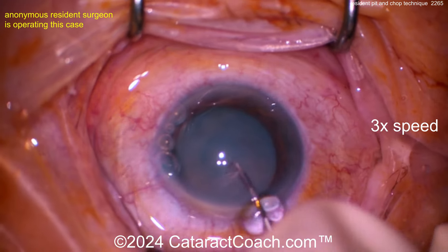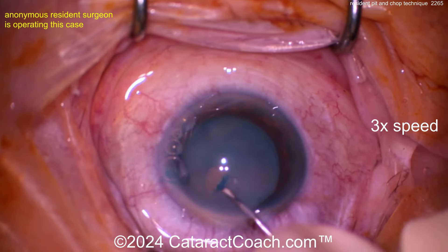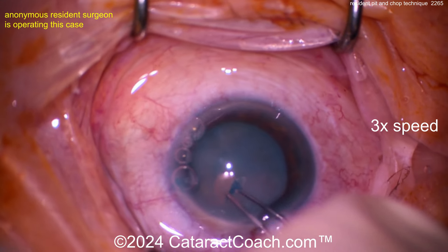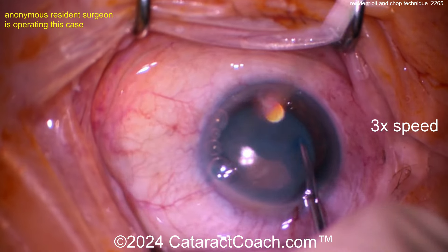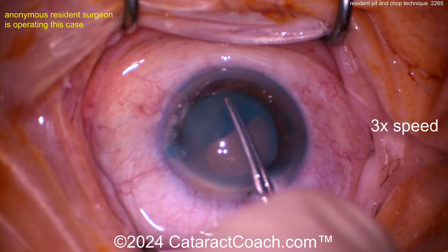Patient looks like under topical anesthesia and so there's not much akinesia — patient's moving the eye a bit. No egress of lens milk or liquefied lens cortex, so probably very low risk of Argentina flag sign. Here comes the rhexis, let's see the pivoting in the incision — pretty good. Look at the pivoting there.